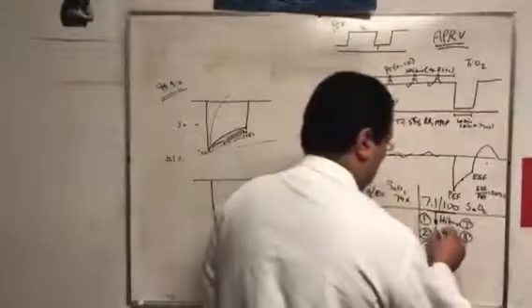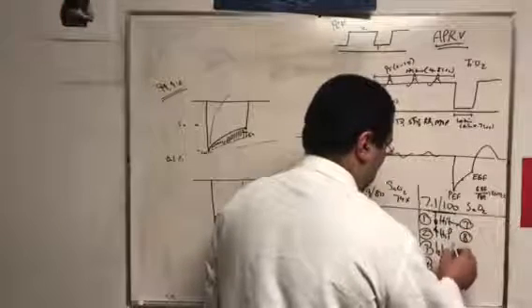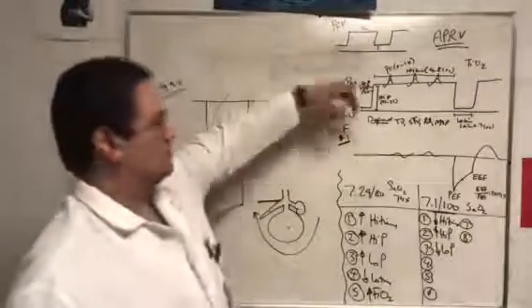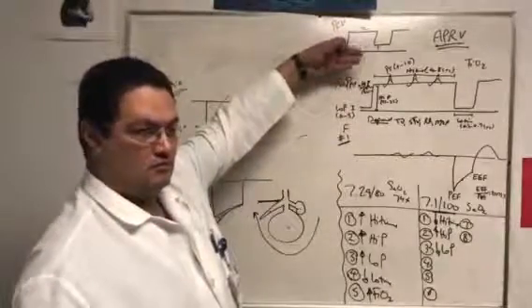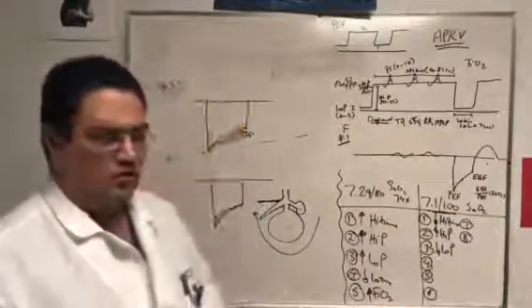And I'm gonna give it a bonus, because that would increase your tidal volume. Bonus. Increase the high pressure and decrease the low pressure by raising this up. Go the whole way down to low, that low pressure, the 0 to 5. Well, you can't go lower than 0.